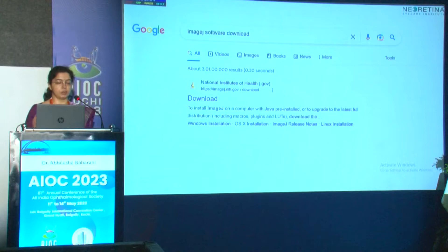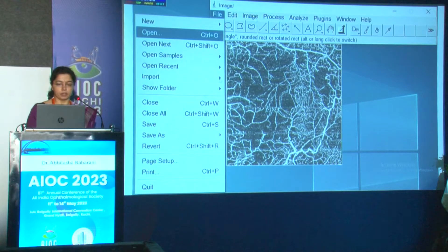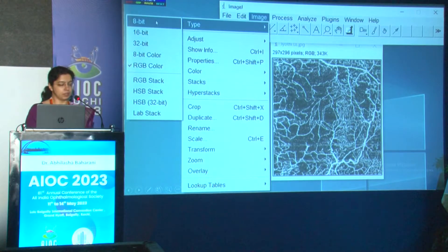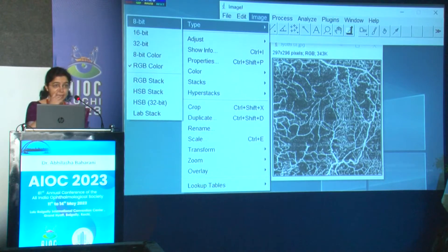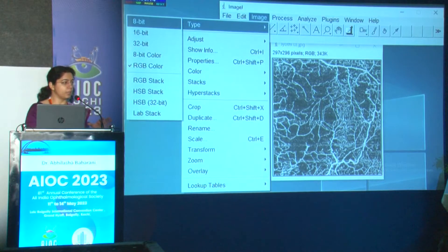You can download this from Google, and whichever image you want to select, you can open that image. Go to File and open the image. Next, in the Image section, go to Type and convert the image into an 8-bit image. An 8-bit image has 256 scales of gray.